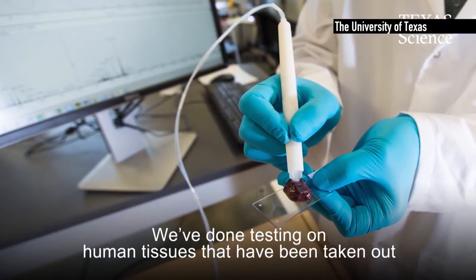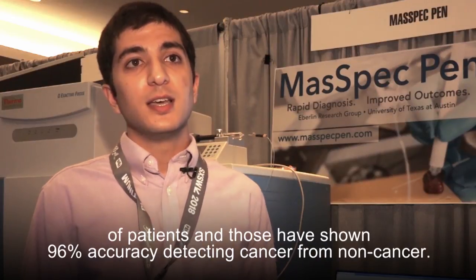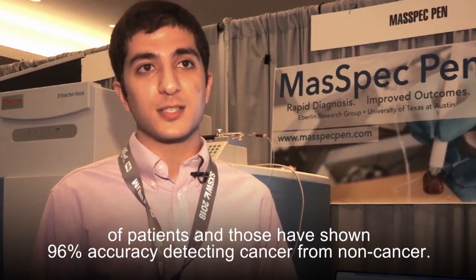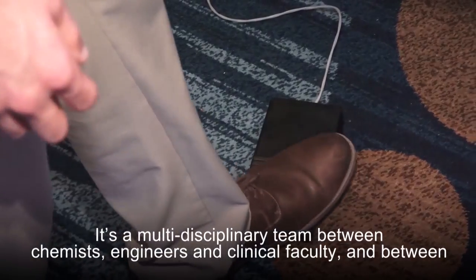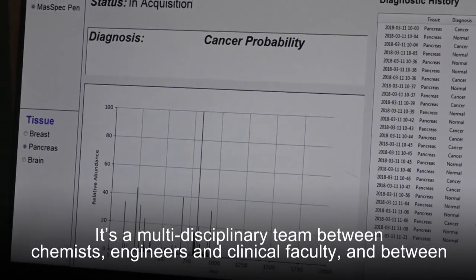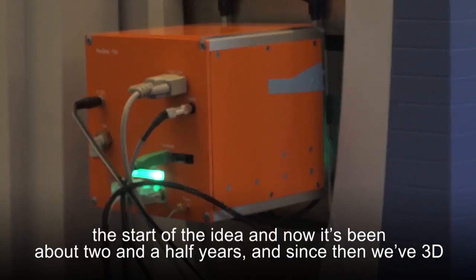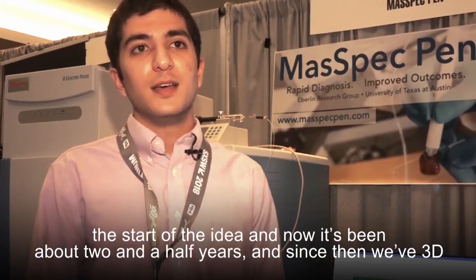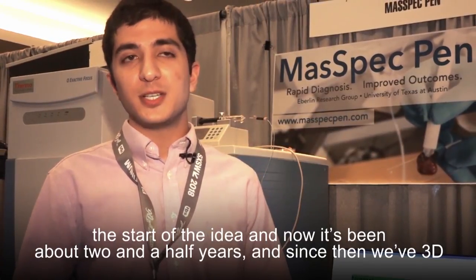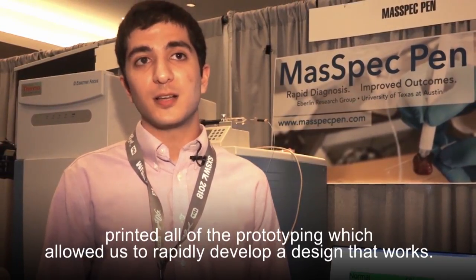We've done testing on human tissues taken out of patients and those have shown 96 percent accuracy detecting cancer from non-cancer. It's a multidisciplinary team between chemists, engineers, and clinical faculty, and between the start of the idea and now it's been about two and a half years. Since then we've 3D printed all the prototyping, which allowed us to rapidly develop a design that works.